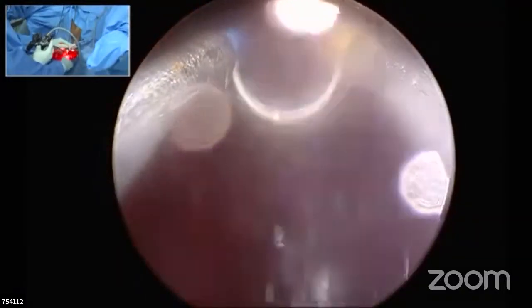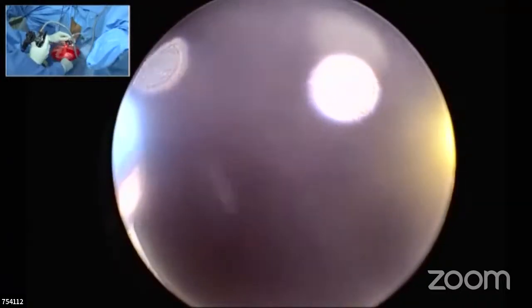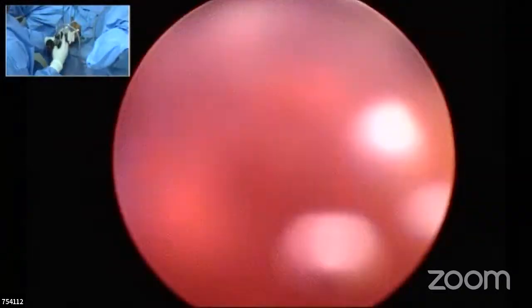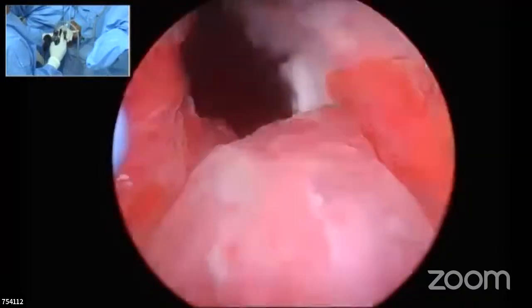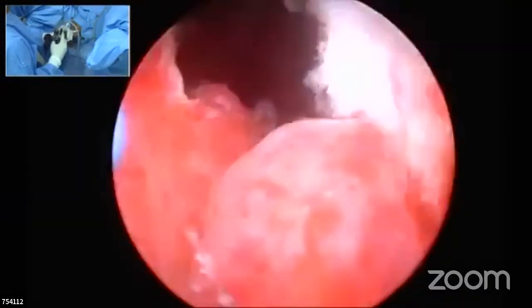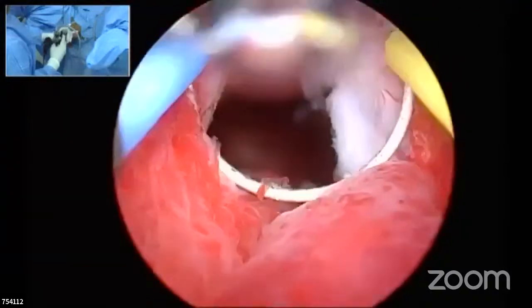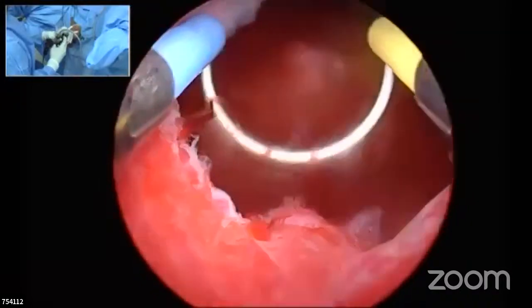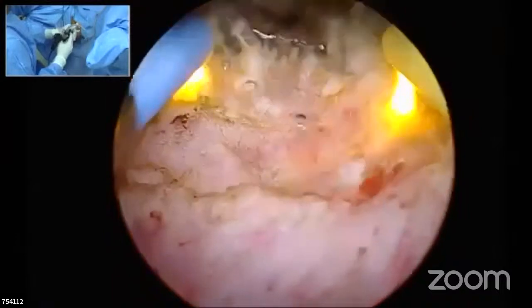Again, you show us with the empty bladder, and yes, I'll show. I haven't finished it. I'll finish it now with this, and I'll show. So I'll go back again and again and see where I have located and how much length I am preserving. My sphincter length is proximal to the verumontanum. So I have preserved an adequate amount of length of the sphincter, and I want to preserve that amount of it.